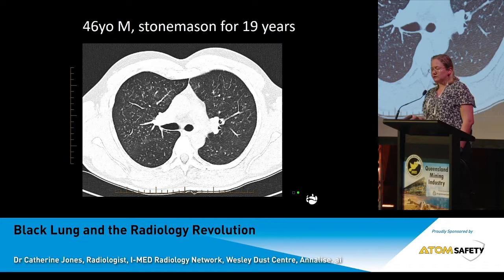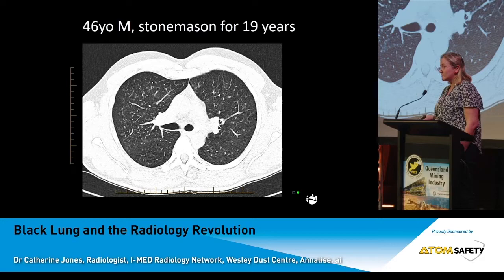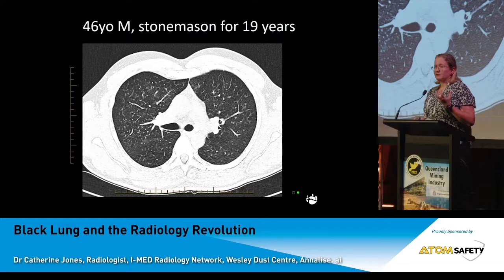This image here shows the patient's lungs that have all these little white dots all the way through it. There's more white dots than there should be, and each one of those white dots is a little bit of dust which has been absorbed into the lungs, and the lungs are unable to cough it back out. And when that happens, you get a little reaction. It's like a scar around that bit of dust. And if those tiny little bits of scar start to get big enough that you can see them on a CT scan, because that's what this picture is, then it tells me that you've got visible scar that's stopping your lungs from expanding. So when you breathe in and breathe out, that ability to expand your lungs and get oxygen in, you start to lose that ability to do that. And over time, and I'll show you some more florid examples throughout the talk, over time it really does restrict your ability to get about your daily activities.